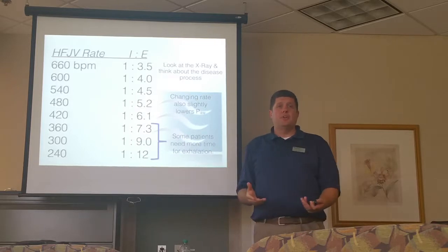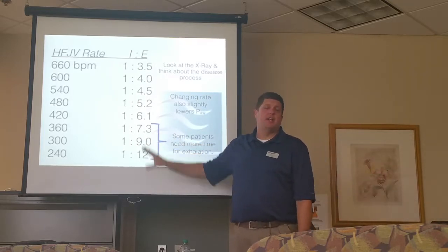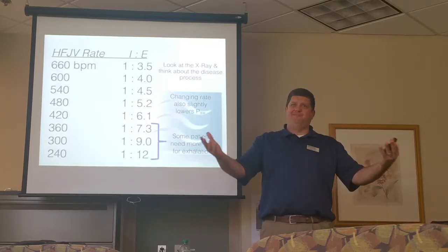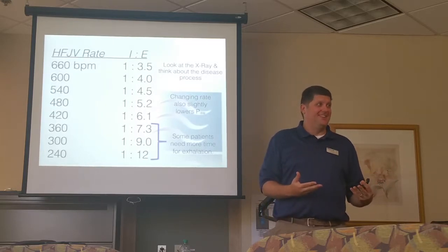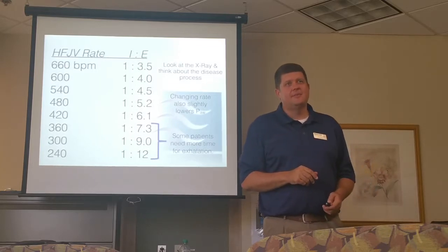And if lung volume looks good, then don't change the rate, leave it alone. The rate on the jet is something that you kind of set and forget. You let it ride. It's a slow and steady wins the race mentality, okay? Now, in the old days it was only just put it on 420 and forget about it.